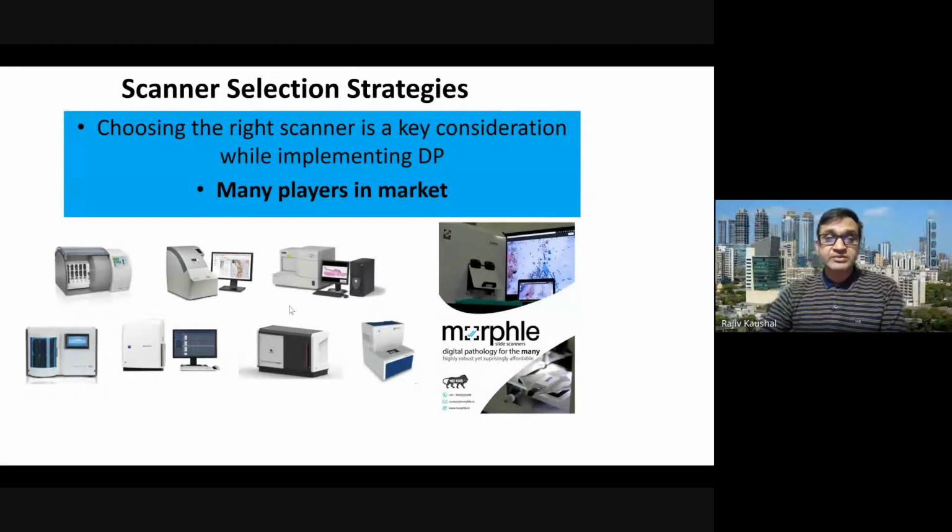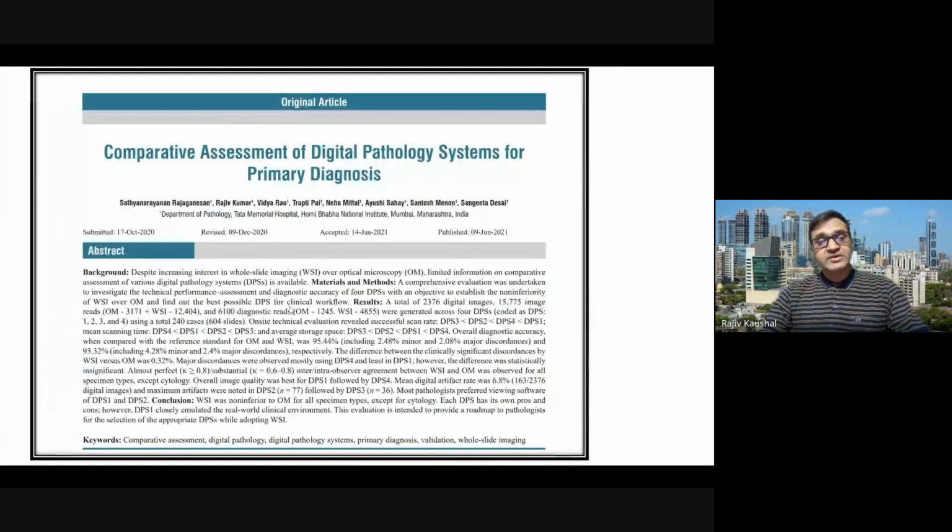Regarding the types of scanners, there are multiple options available, and many of them are very close to each other, and it is very difficult to find out the differences, but if you see the specifications of all these scanners very carefully, you will find the subtle differences. That's why it is recommended, before adopting this technology, that you pay attention to the scanner specifications very critically, so that you do not regret at the end that you have made the investment in the wrong system.